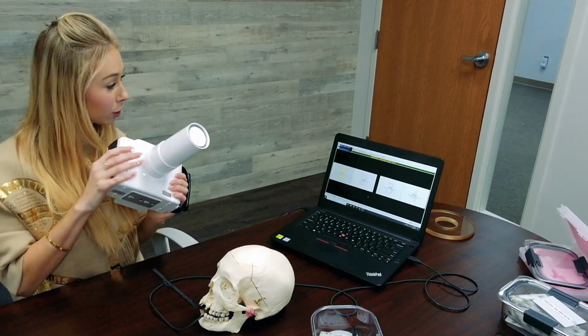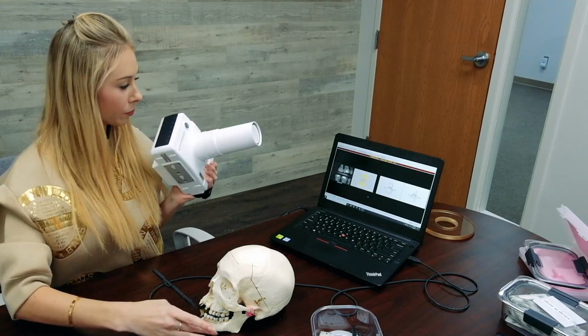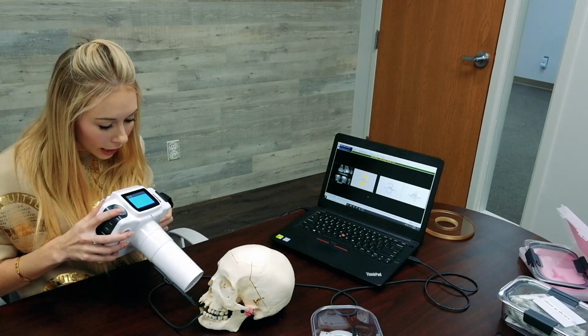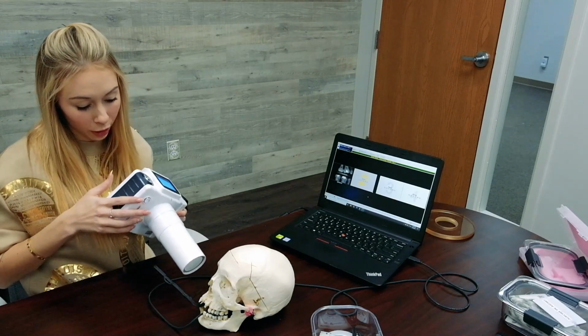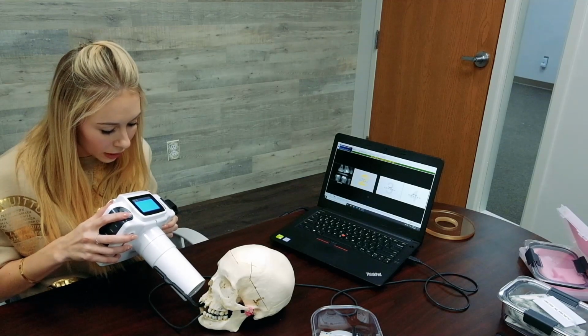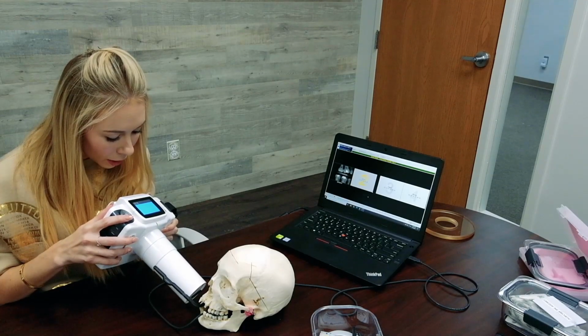All right, I'm going to look for the first image here on the x-ray vision. All right, I'm going to go ahead and take the second image here. And again, Mr. Ed Bones can't move for me. Right now I'd be moving for a different bite wing image, but since he can't, I'm going to go ahead and just stay with the same placement here, reline everything up, and go ahead and take the second bite wing image.